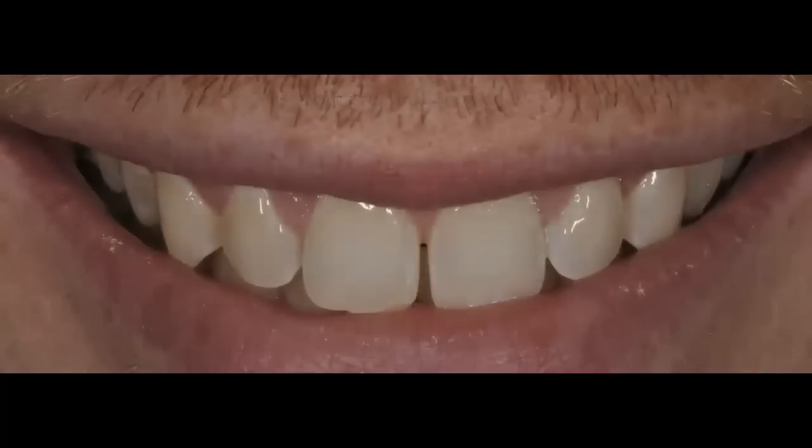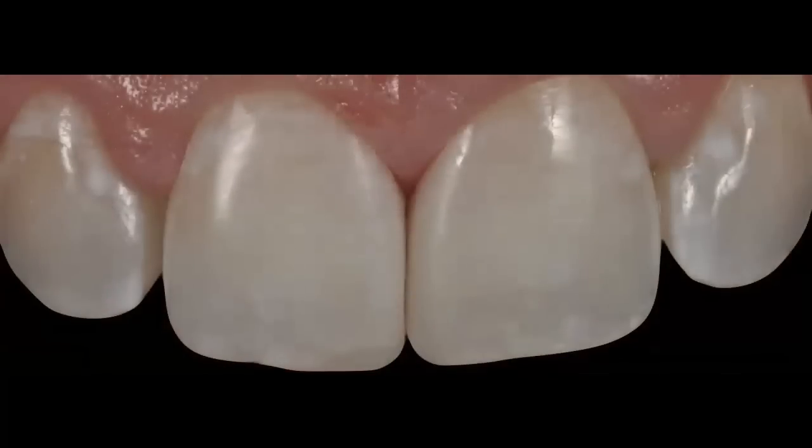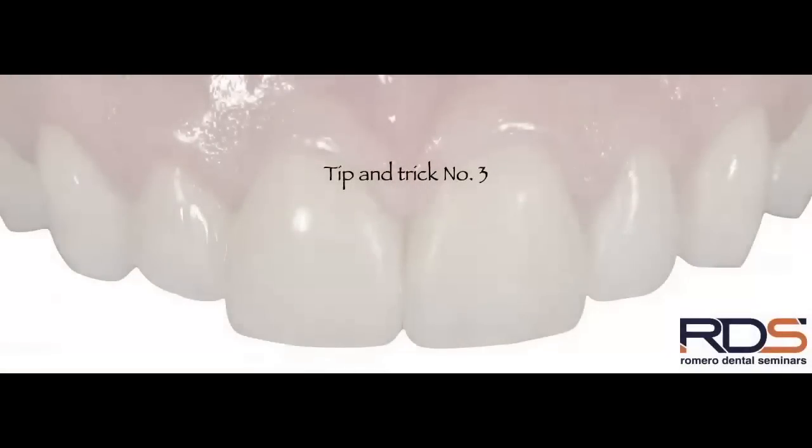Now you will have cases like this where these are 100% additive cases. This patient came to me because he wanted the diastema between 8 and 9 closed. So I have to add to close that space. And if I have to add to close the space, there is no need for me to prepare. So that's why you have to ask yourself the question, is there preparation needed, yes or no? And when you find that there is no preparation needed because you have enough space, because you have to fill a space, then by all means, just go about restoring the tooth by means of no preparation.